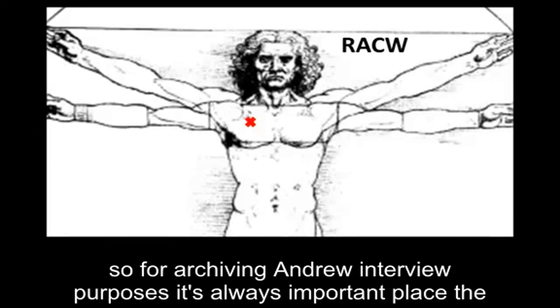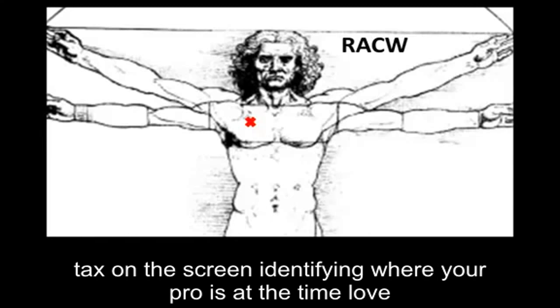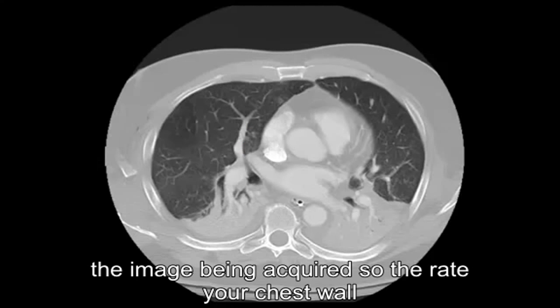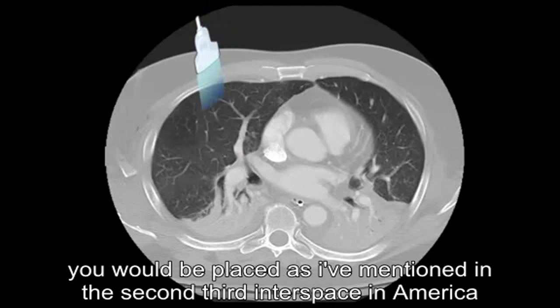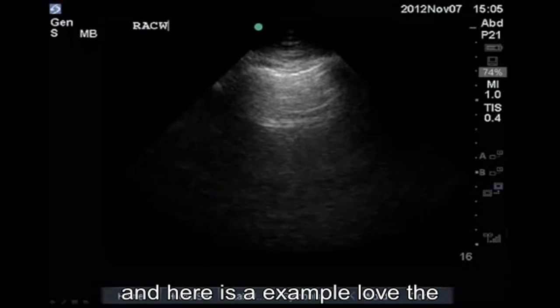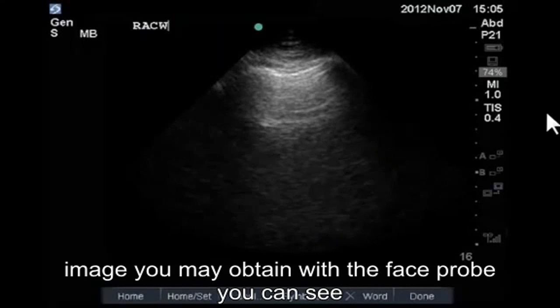So for archiving and image review purposes, it's always important to place the text on the screen identifying where your probe is at the time of the image being acquired. So the right anterior chest wall view would be placed, as I've mentioned, in the second or third interspace in the midclavicular line. And here is an example of the image you may obtain with the phased probe.